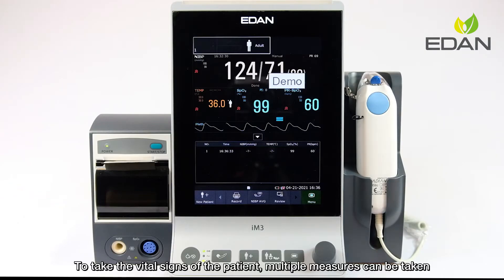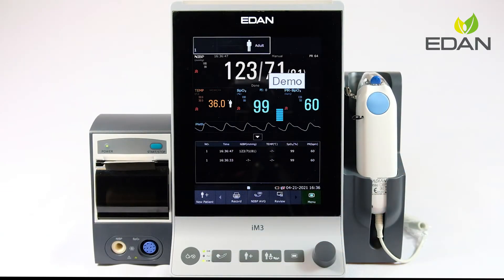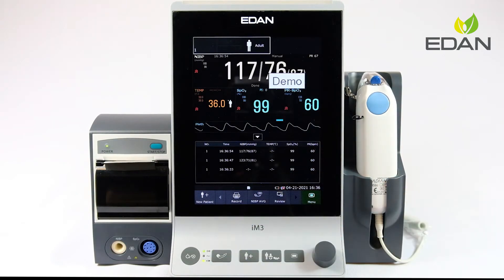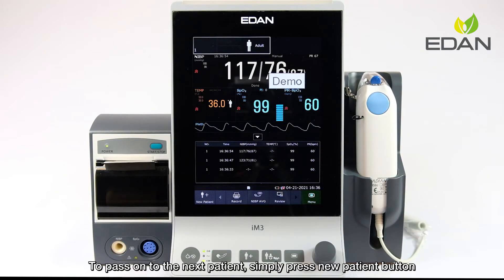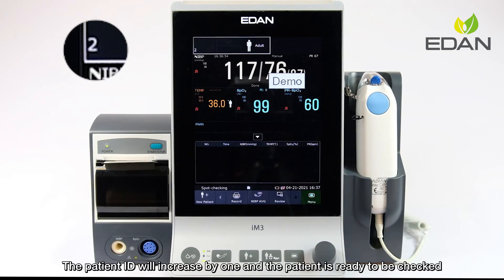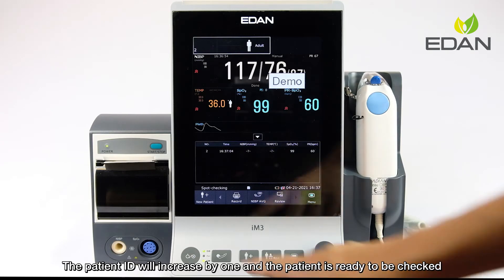To take the vital signs of the patient, multiple measures can be taken. To pass on to the next patient, simply press the new patient button. The patient ID will increase by 1, and the patient is ready to be checked.